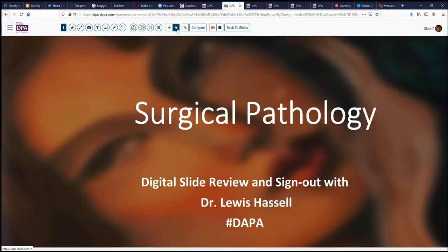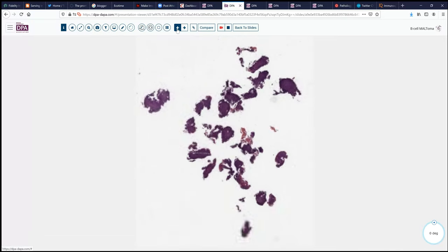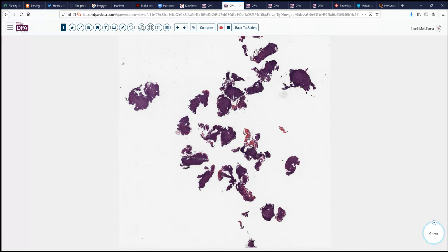Today we're going to take another case from the realm of GI pathology. This is a 48-year-old woman with rather long-standing dyspepsia and abnormal-appearing gastric mucosa, which led to some endoscopic biopsies, as might be anticipated. We can see at very low power that these are quite abnormal.